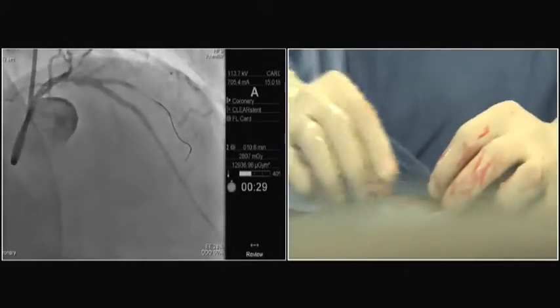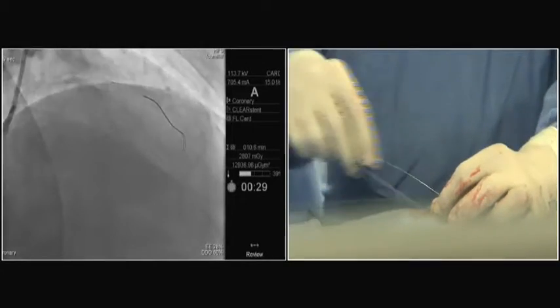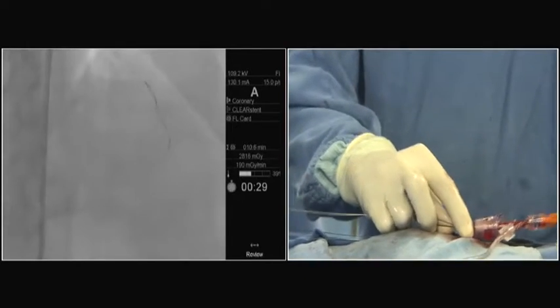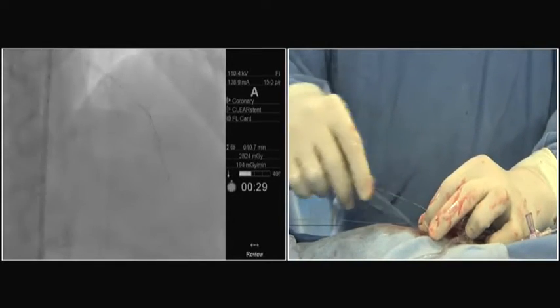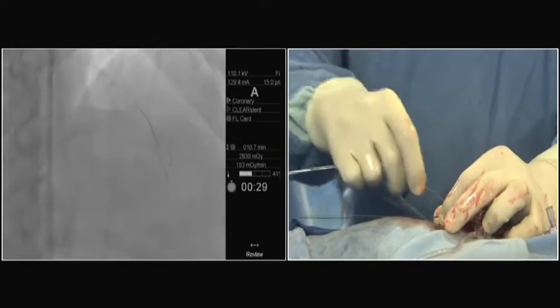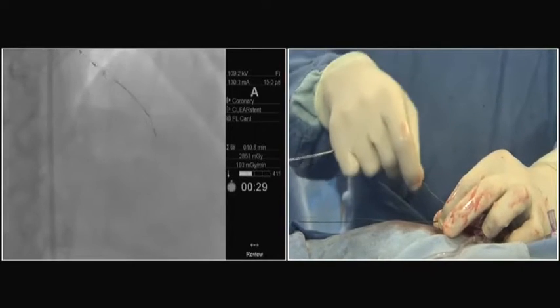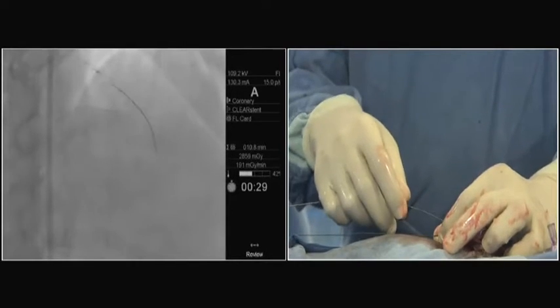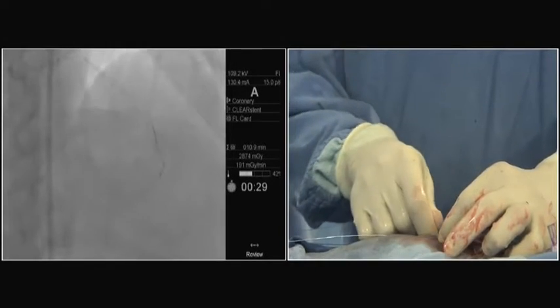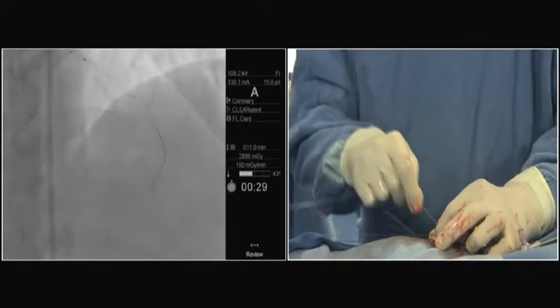Because this is sort of a classic mini crush, you are now going to use the small diameter balloon to open up the struts? Yes, I've taken a 2 millimeter balloon to open the struts. I think it could be useful to check where you cross with the side branch wire before inflating balloons with IVUS. Okay, we can do that. If you have some difficulty to go through, that means it could be.